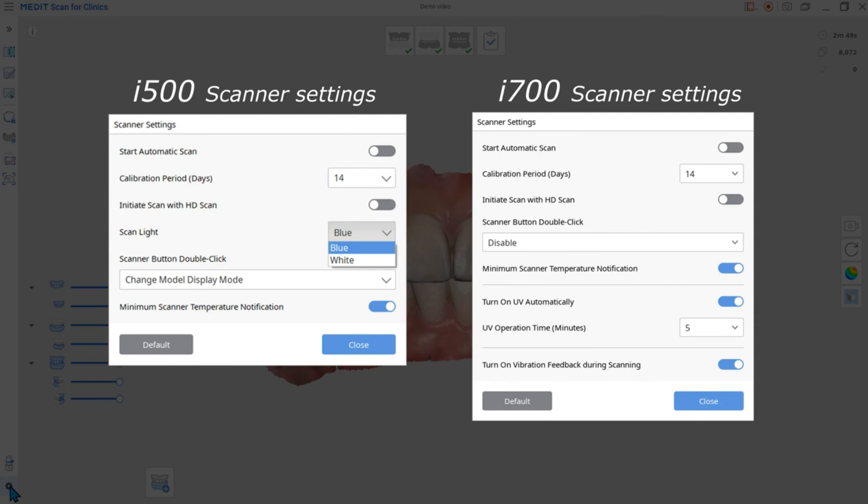The following settings are only for the I700. The first feature is Turn UV on automatically. This feature automatically turns on the UV light when the scanner is idle. It won't hurt patients since it's solely for disinfecting the inside of the scanner. It will be turned off during scanning and after a certain period of time.